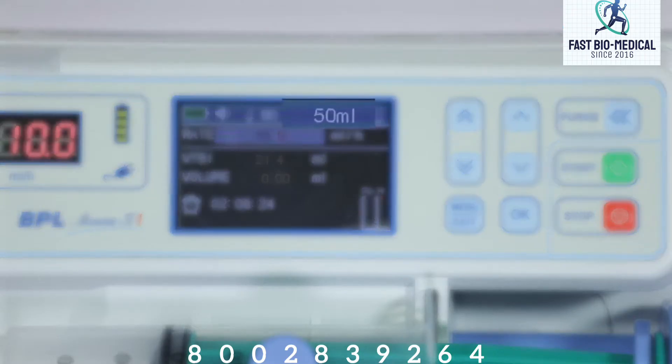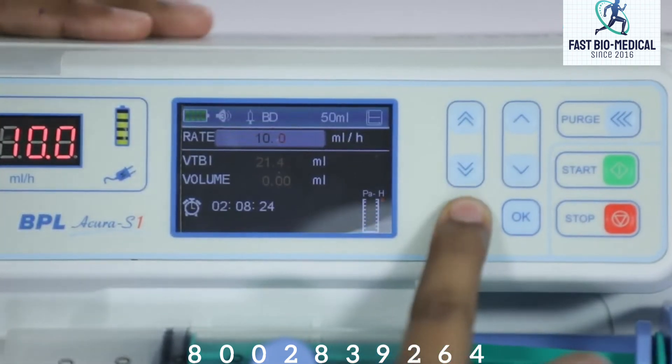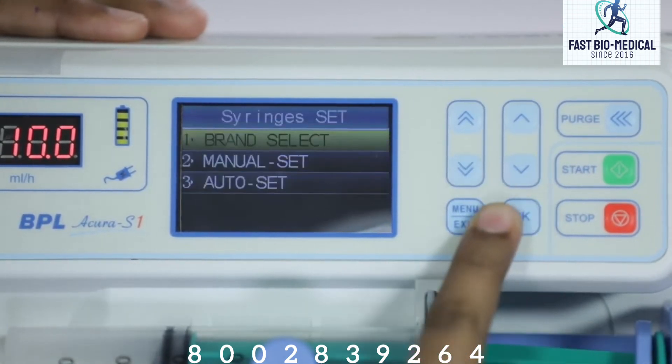The display will show the volume size of the syringe — please check if it is correct. You can select the syringe brand by entering the main menu. In the syringe set menu you can select the brand of the syringe being used.